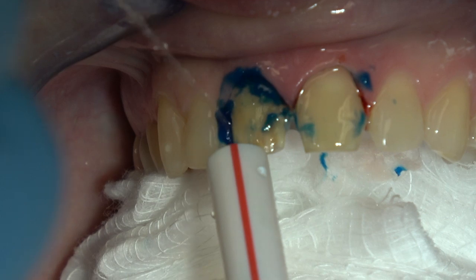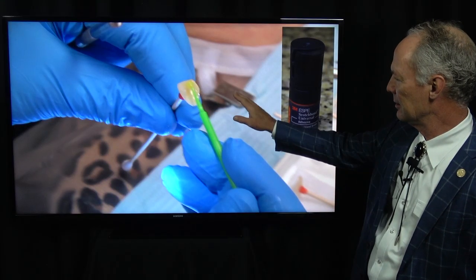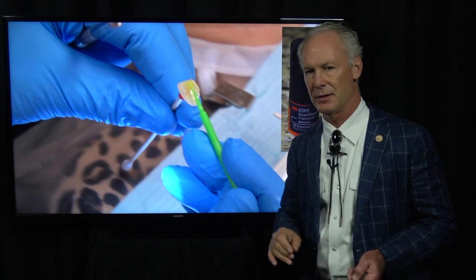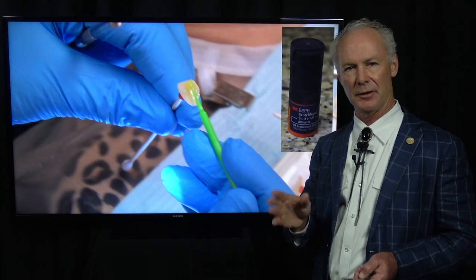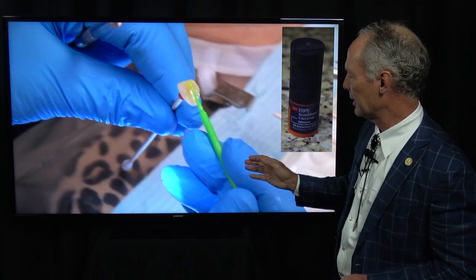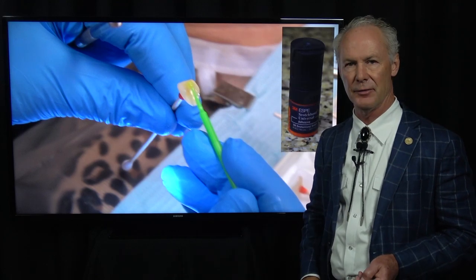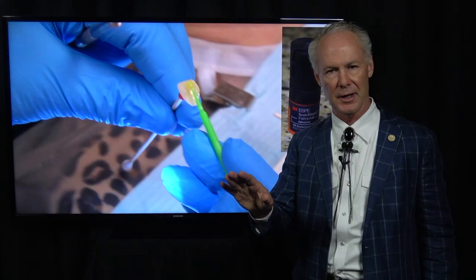I'm suctioning this off while squirting ice cold water on the tooth. You can see how the bleeding has scabbed over. These veneers have been etched with 8% hydrofluoric acid in the lab, and then placed in an ultrasonic to get rid of the chalky layer — it's very important that that happens. If the chalky layer is on the tooth side of the veneer, you know the technician is not putting them in an ultrasonic.